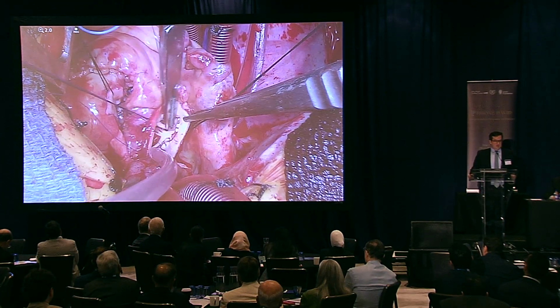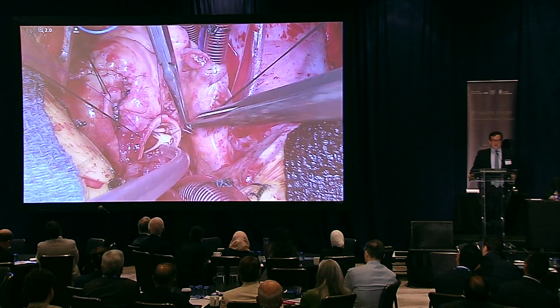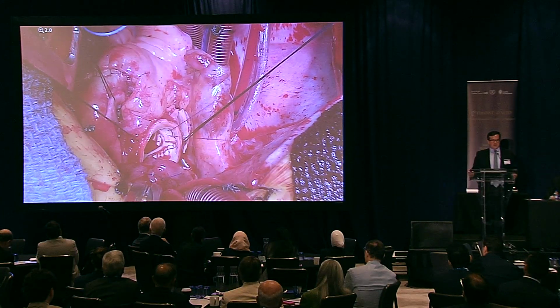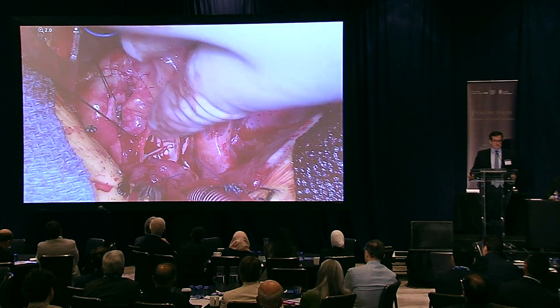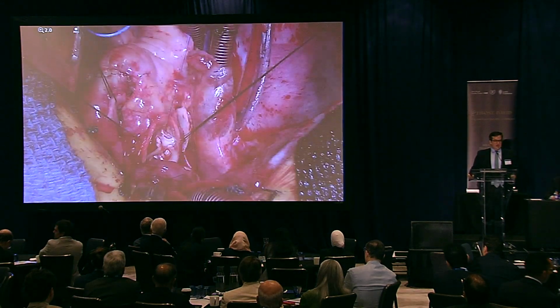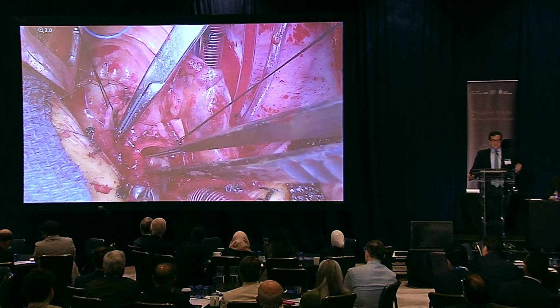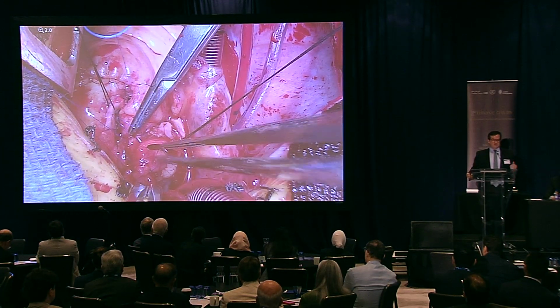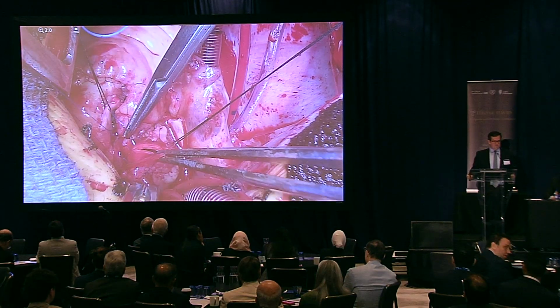is very thin. And we're making sure that we're not interfering with the leaflets. You have to take it deeper into the body, leave a little space away from the leaflet itself, so that once you tie this down, you're not touching the leaflet with your pledgets. And again, I want to emphasize that it's a deep stitch into the subcommissural triangle. It's not just at the very top of the commissure. You really need to close that space in order to bring this down.